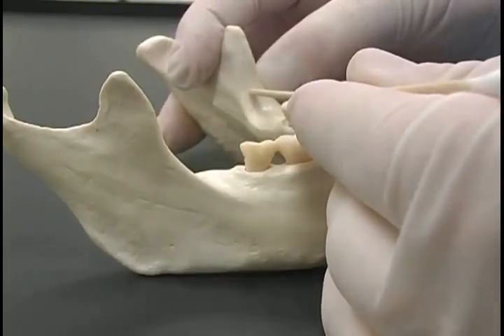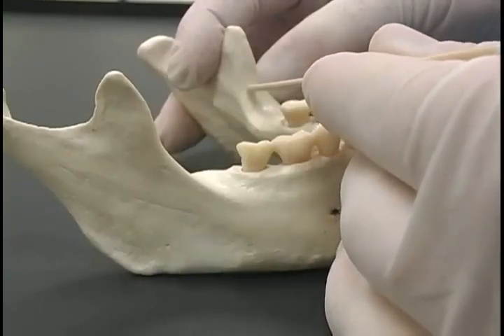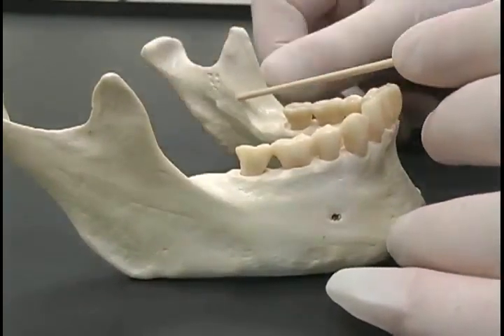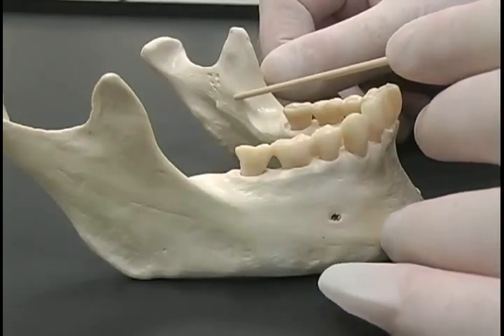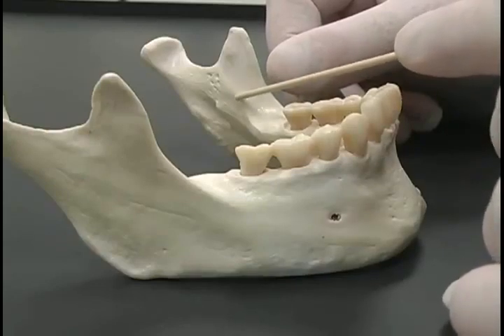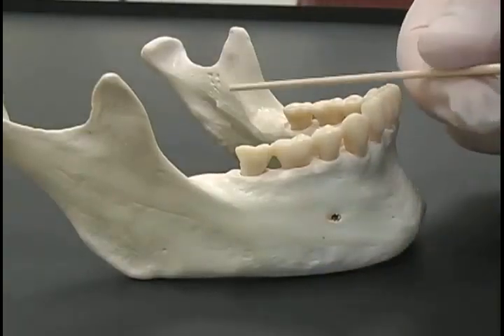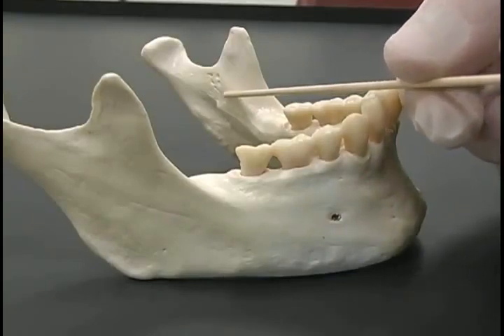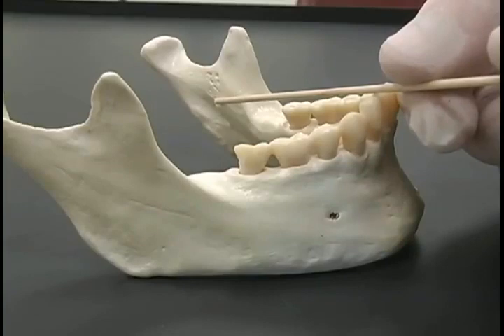After leaving maybe a quarter of the carpule for the lingual nerve, you need to change direction and navigate past the internal oblique ridge. As soon as you feel that the bony contact is gone and you have come behind the internal oblique ridge, make sure that you change the location back to about the other canine area, and then continue posteriorly to reach the entrance point of the mandibular nerve.